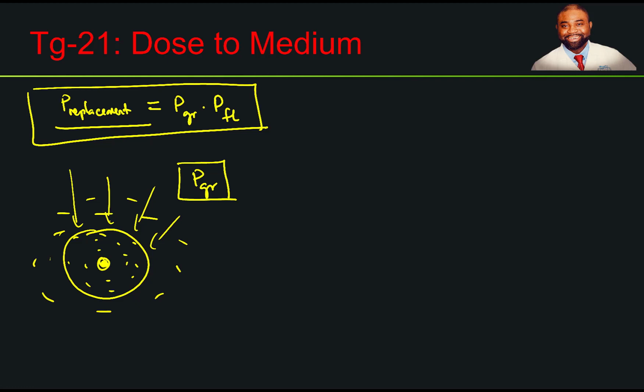For electrons, where the measurements are taken at Dmax, or where the LINAC is calibrated at Dmax, the gradient correction factor is equal to 1 because there is no gradient. But for photons, the protocol recommends that the gradient correction factor should be based on taking into consideration the effective point of measurement. Otherwise, you would have to factor that into play in your measurements.